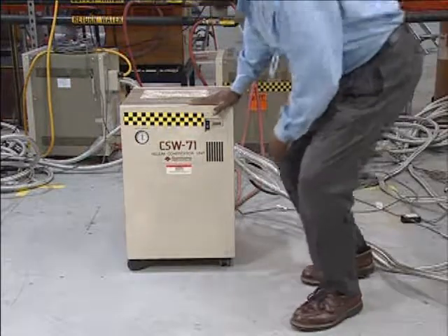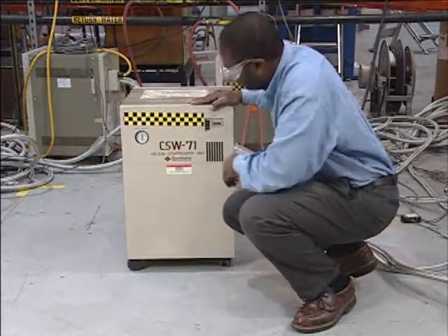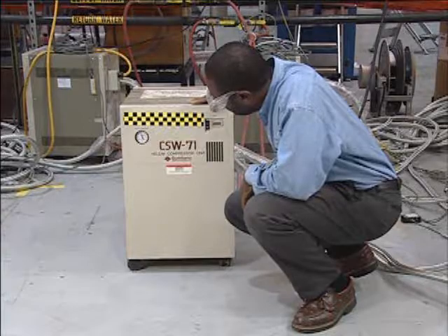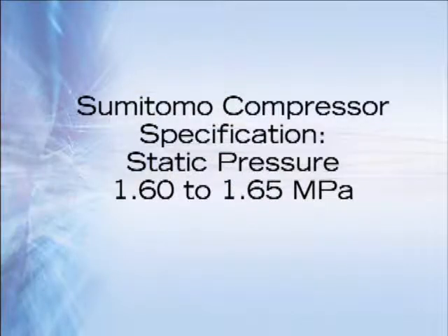The dynamic pressure state should be checked while the compressor is in operation. The static pressure should be checked when the compressor is off for a period of time, and should also be checked after a cold head change. Note that it might take an hour for the compressor to indicate the actual static pressure.